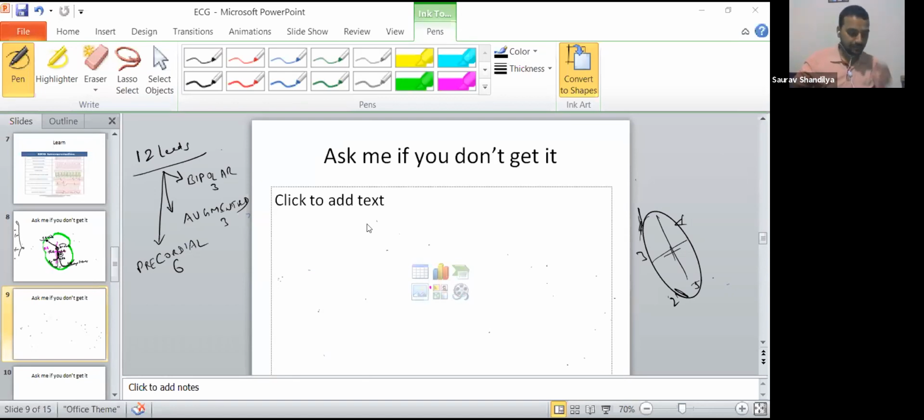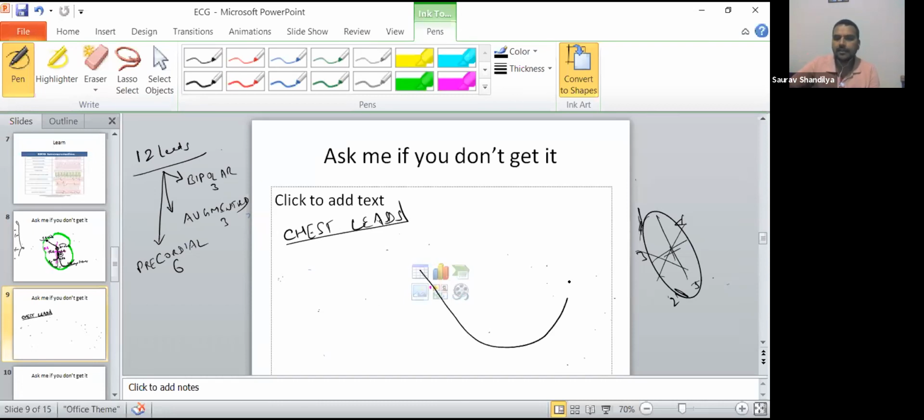Well, so after this, now we have the most important leads. I mean, one of the most important, in fact very important for physiotherapists, I believe, the chest leads, what you call the precordial leads. Those who are confused, I told you it is just to create the new version of recording, three more versions of recording. The more you record, the better, right? More data, much better. Okay, fine. Now, how do we record the ventricles?